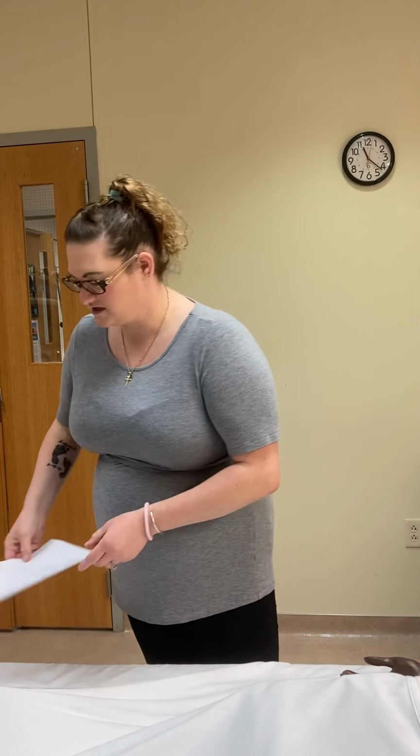Okay, so for this video, we're going to go over blood transfusions. So this is going to be initiating and monitoring blood therapy. Critical elements for this are on Blackboard, so that you'll be able to follow those as you go through in preparation for testing.